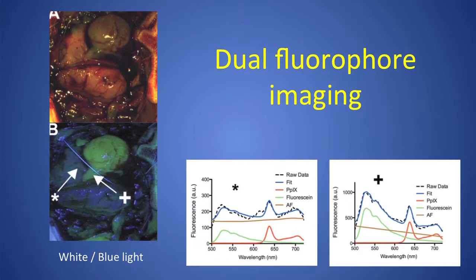As a surgeon, you can make the workflow more efficient if you provide that information in a heads-up display. When we use an operating microscope, we're looking at the surgical field, and we can superpose on the surgical field an outline of a tumor that's derived from the information in that MRI scan. And the surgeon has that information right in front of him or her.